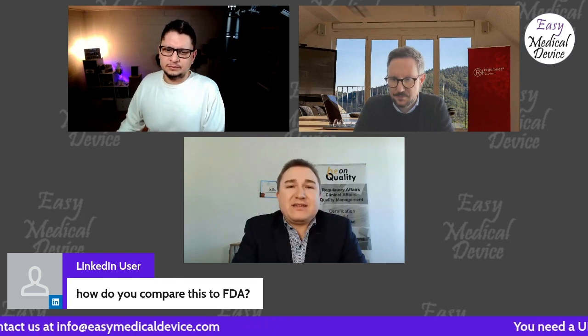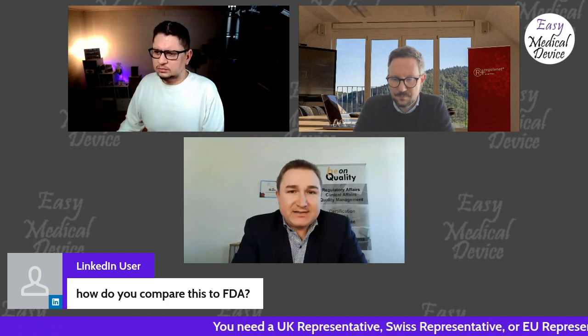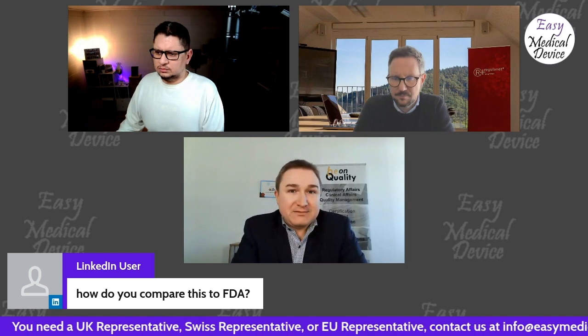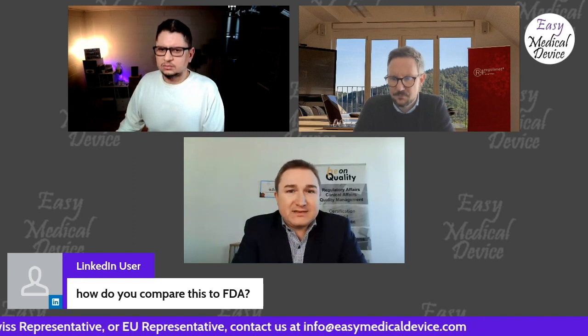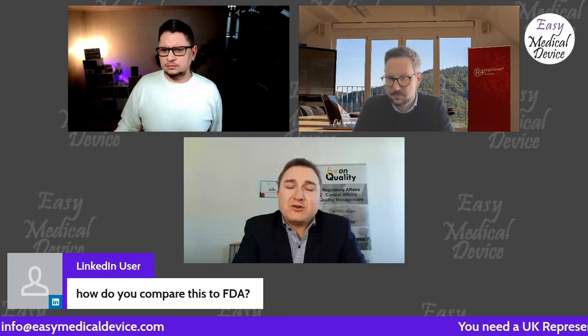Yes, FDA has another rule set than we have in Europe. They don't have rules, they have regulation IDs, and the regulation IDs decide the classification. So solely for today, within this LinkedIn Live, we are speaking about the European system and the European classification. But I tend to think that we can do an additional one for the US or something like that.